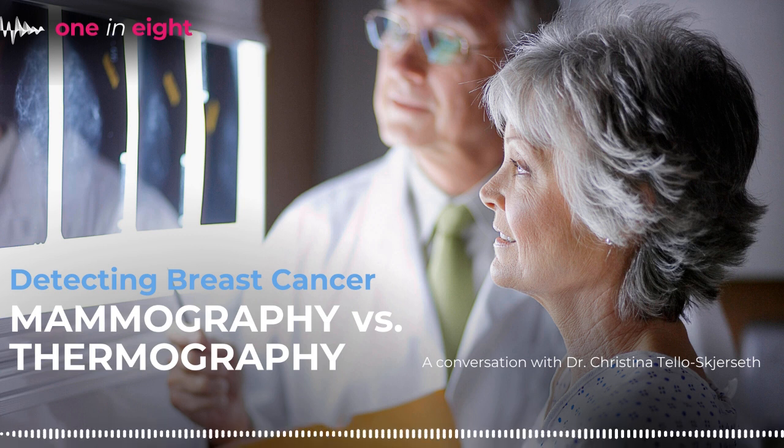But again, thermography really doesn't have any data behind it showing that it can detect breast cancer and that it's a good standalone tool. And it's not approved to be a breast cancer screening modality on its own. Sure. And like you said, if they were to detect anything, then a mammogram in most cases is the next step. Exactly. When you really think about it, it's a camera that's detecting the temperature of your skin. So anything that's increasing your temperature in that area could cause a positive thermogram. I could touch my breast and just put a little pressure on it. That'll increase the heat there. Being outside will increase the heat. There's lots of things. Any type of inflammation will increase that heat. So it's not specific for cancer.